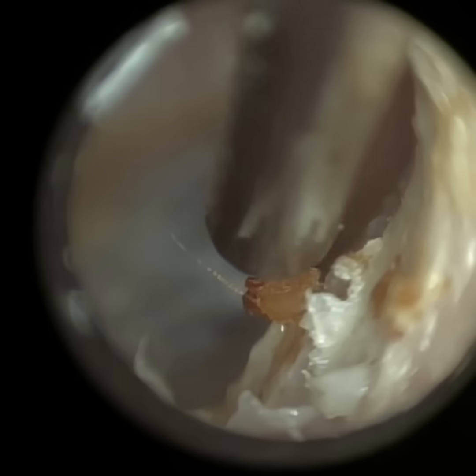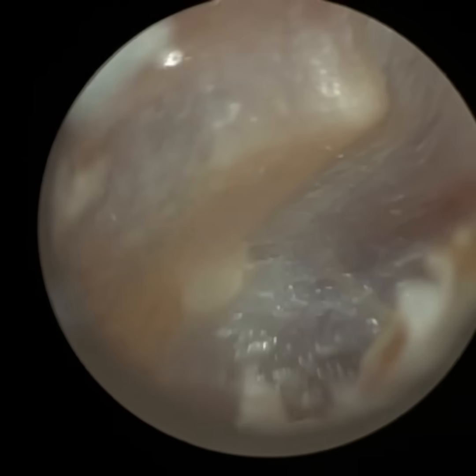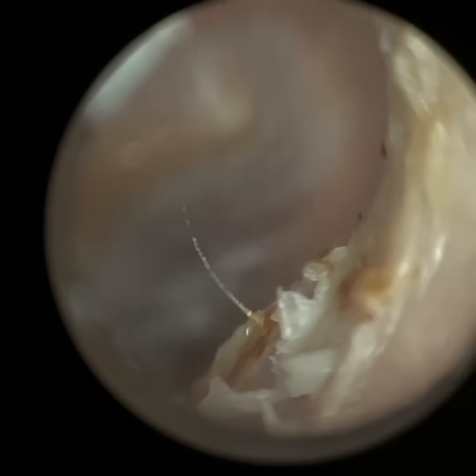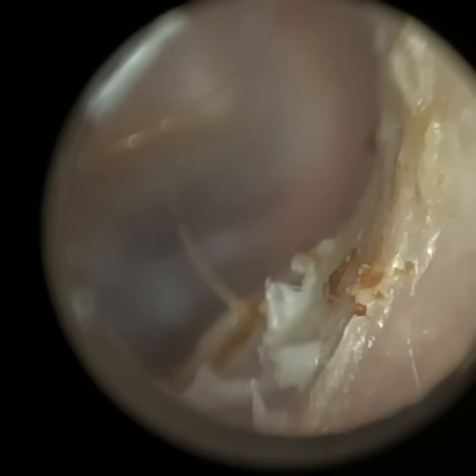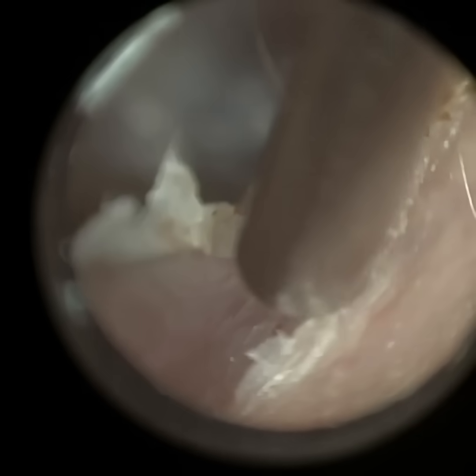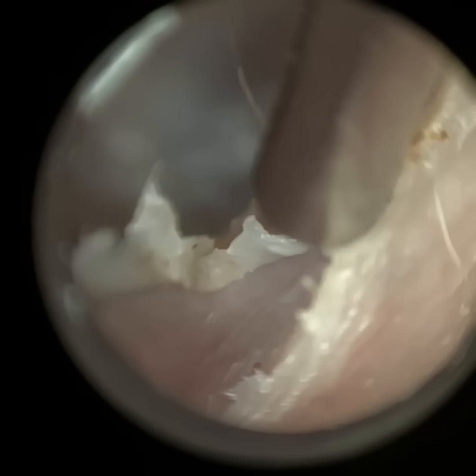With the Waxscope everything is so magnified, even in comparison to an endoscope. There's just a little bit more debris on the anterior canal wall that I want to try and peel away. I've just reduced the brightness as well, because when you've got a lot of dead skin it's very reflective — it appears white and can blur the view. By turning down the exposure you reduce any reflections. With the magnification you can work very closely to the canal without making contact.